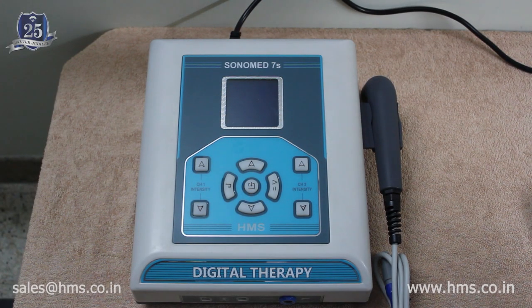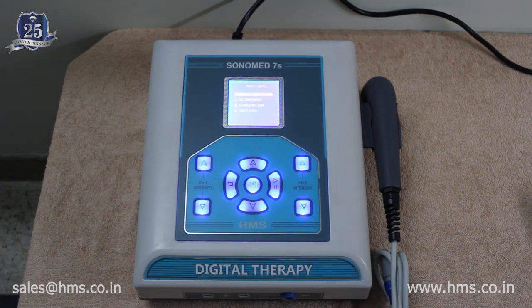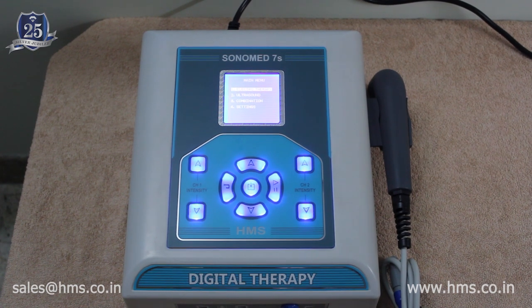Plug the power cable into the back of the machine, and there is a power button at the back which you need to switch on. It's very simple to switch on the machine. We also provide a very good display and backlit keys for easy navigation. Now let's get into the functions of the Sonomat 7S.